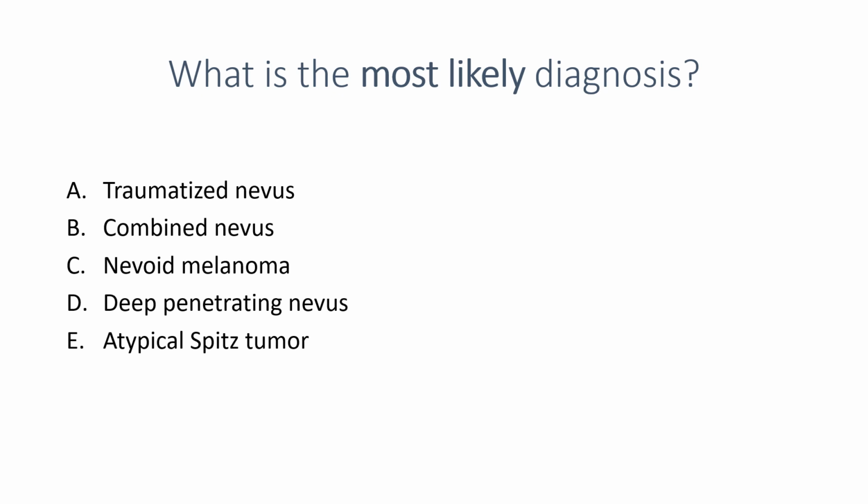A. Traumatized nevus, B. Combined nevus, C. Nevoid melanoma, D. Deep penetrating nevus, or E. Atypical Spitz tumor. The most likely diagnosis is C. Nevoid melanoma.